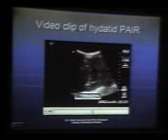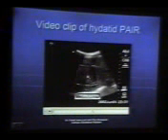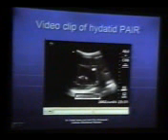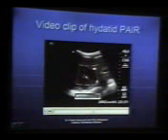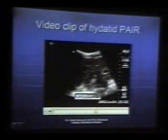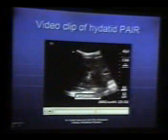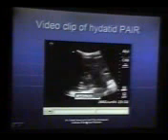This is the saline being injected, hypertonic saline, and that turbulence can also be seen on the Doppler. Hypertonic saline, and some of the air bubbles which came in.